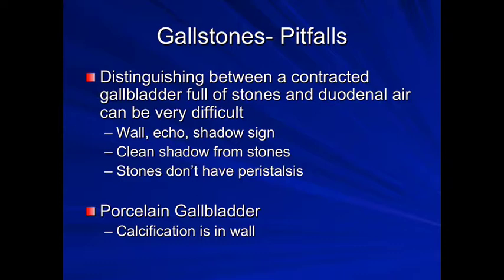Sometimes you can give the patient some water to drink. We usually get them to drink through a straw so they don't swallow air, and then you can wait and watch as that liquid comes down through the stomach, through the pylorus, and into the duodenum. But that's often difficult. If the patient's in pain particularly, then they may have delayed gastric emptying, so it's not actually as useful as it may sound.